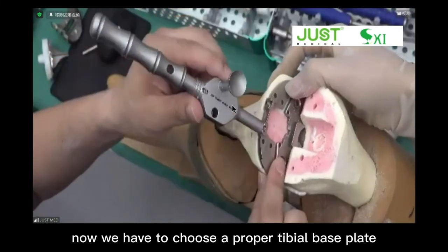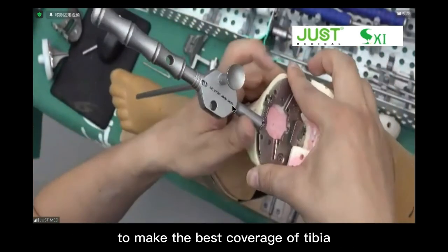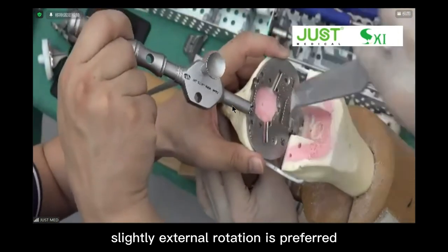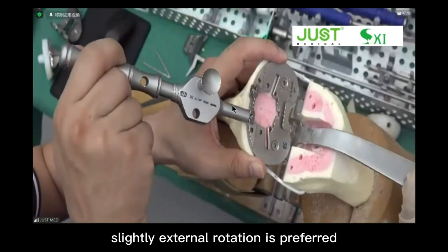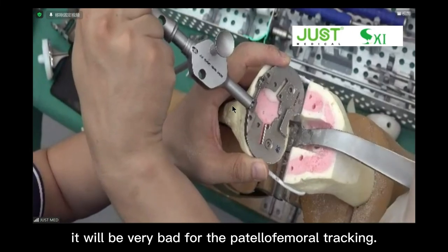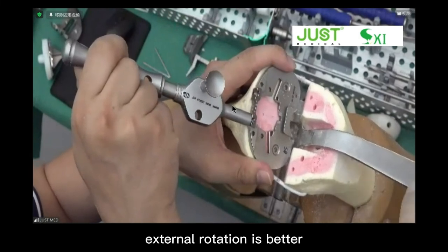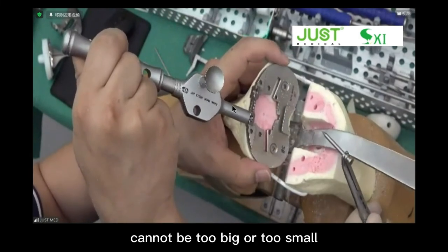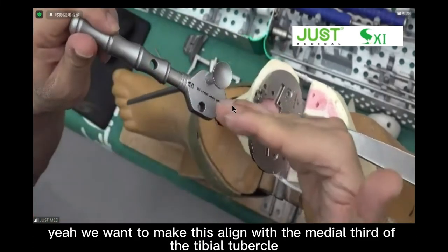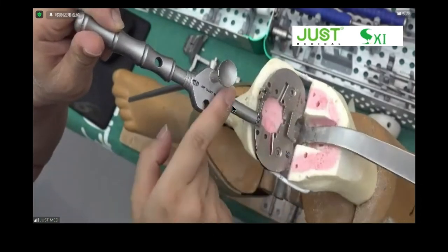Now we have to choose a proper tibial base plate to make the best coverage of the tibia. Slightly external rotation is preferred because internal rotation will be very bad for the patellofemoral tracking. Slightly external rotation is better. You need to find the best coverage. It cannot be too big or too small. We want to align this with the medial third of the tibial tubercle. Then you get a proper rotation.